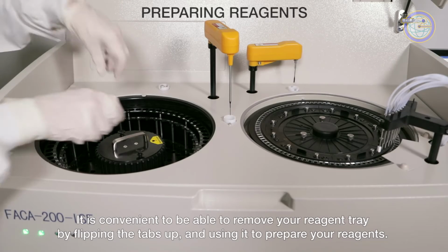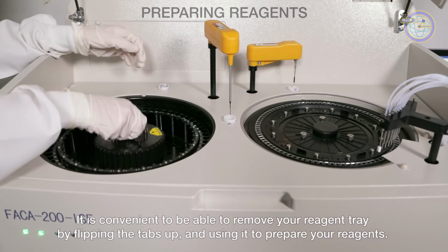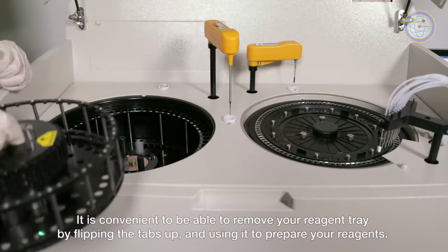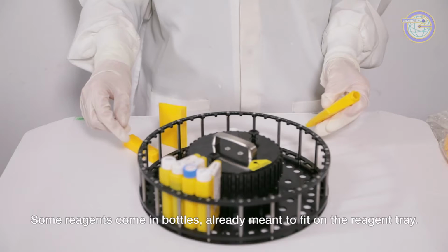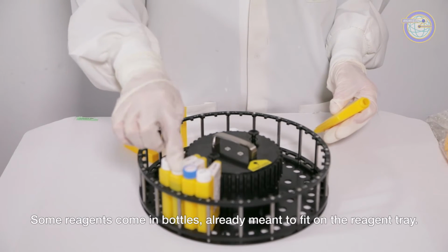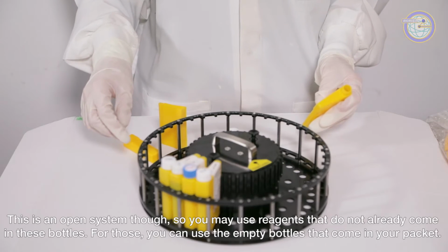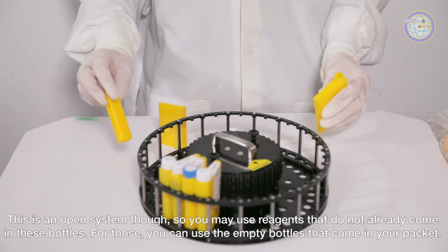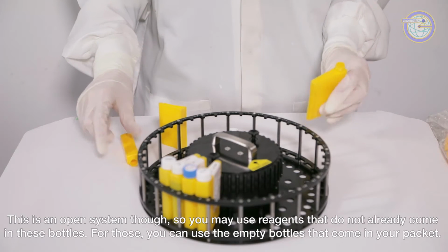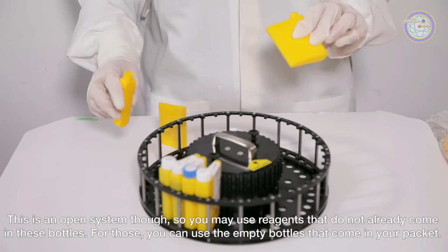It is convenient to be able to remove your reagent tray by flipping the tabs up and using it to prepare your reagents. Some reagents come in bottles already meant to fit on the reagent tray. This is an open system though, so you may use reagents that do not already come in these bottles. For those, you can use the empty bottles that come in your packet.